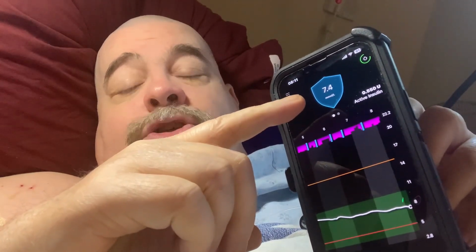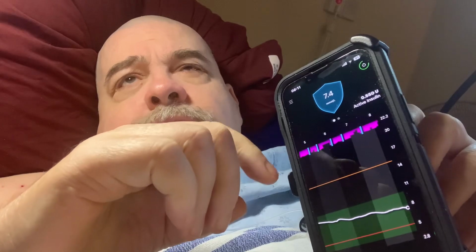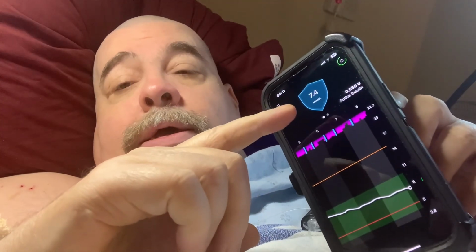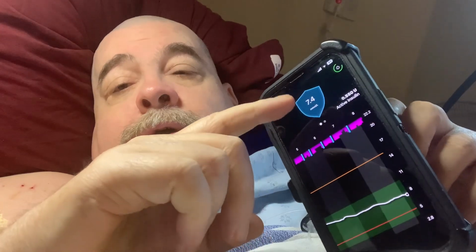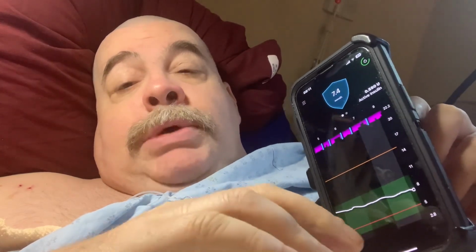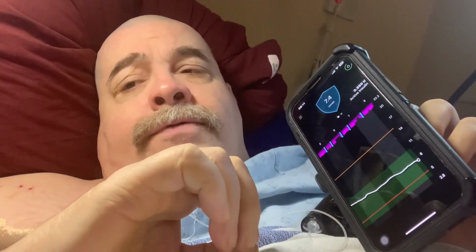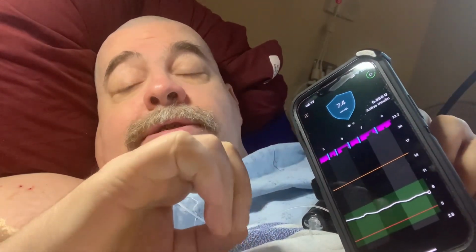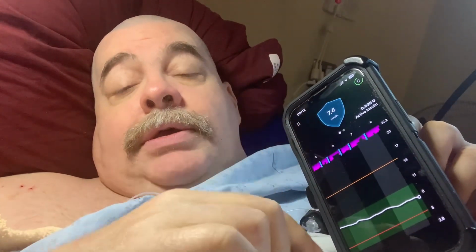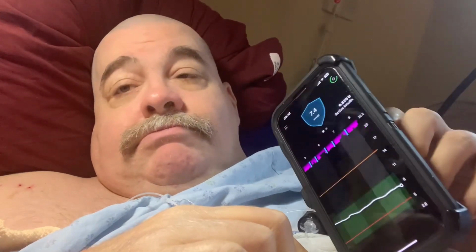With the Medtronic 780G and 770G and 680G or whatever numbers were, the pump preceding my pump come with this auto mode, which automatically takes over. Doesn't mean you don't have to watch, you don't have to worry about it. Far from it, but it takes an awful lot of worry out of it. You can always distinguish whether you're in auto mode or manual mode by this little blue shield around the number. Easy peasy, right? Okay.